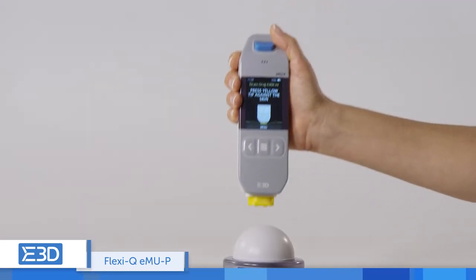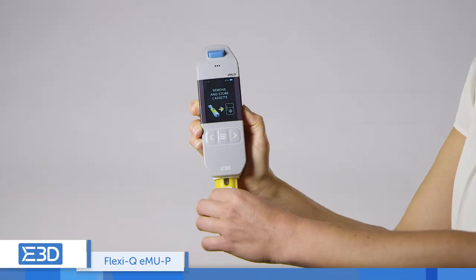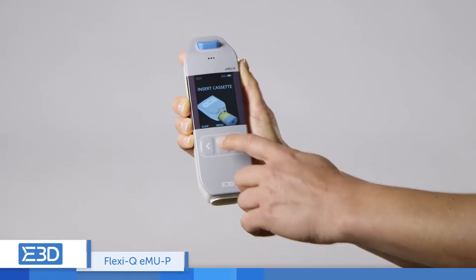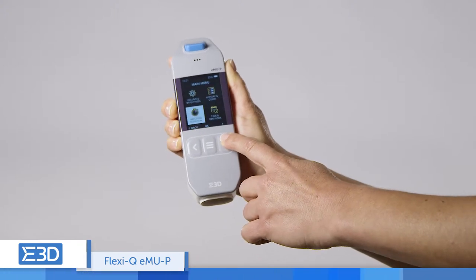The EMUP is safe and easy to use, featuring advanced human interface, fully automatic injection process, and a fully protected needle. Its patient-physician connectivity, data recording, and injection reminder capabilities further improve compliance.